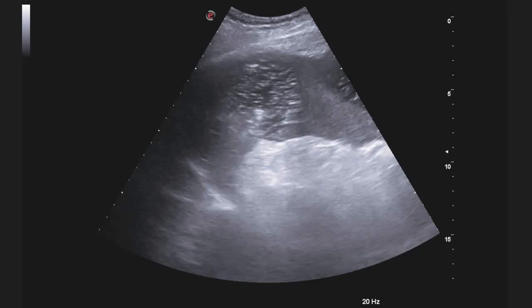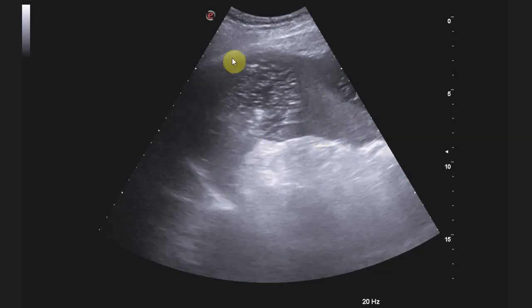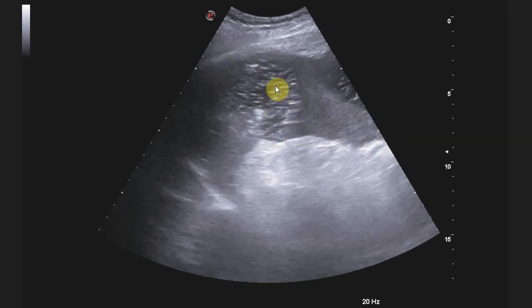The interesting finding in this abdominal ultrasound was seen in his spleen. The spleen was markedly enlarged and it had these lesions. Here is the spleen — this is normal splenic tissue, all of this is spleen. But this here is a lesion, and this lesion has a hypoechoic background with hyperechoic foci within it.